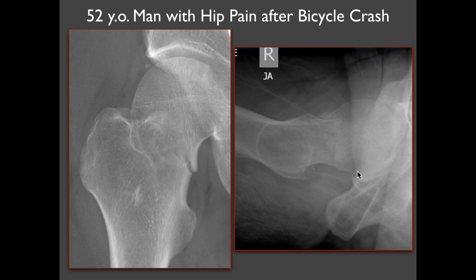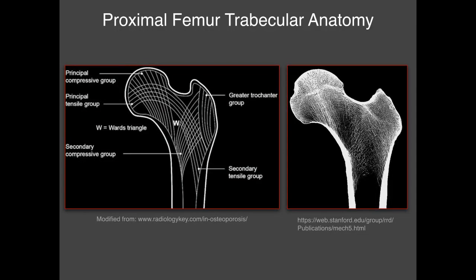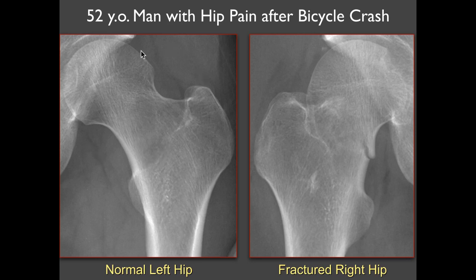You really want to scrutinize the true lateral view for little deviations or lucencies, because these fractures can be very subtle. The trabecular pattern in the proximal femur is important to be aware of — helpful in fracture detection. There's a principal compressive group, a secondary compressive group, and a tensile group that goes curvilinear. They're helpful for looking at the normal expected pattern of trabeculae and continuity. In the case of the fracture, those trabeculae are interrupted.